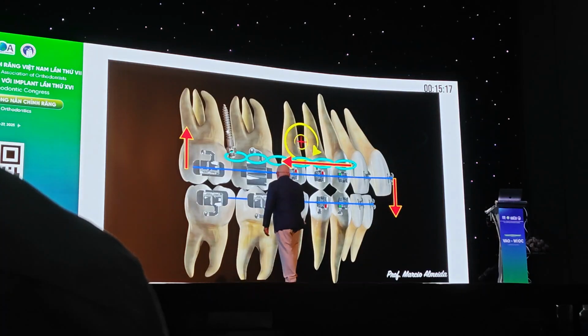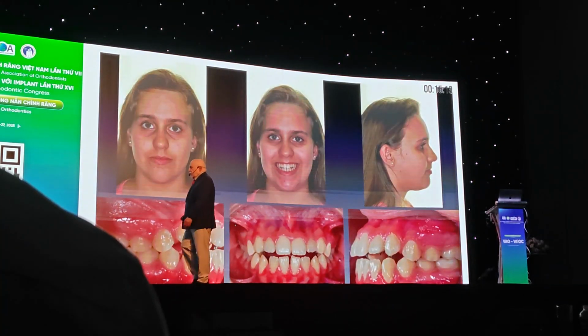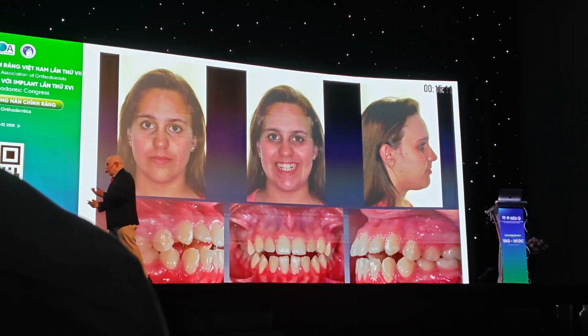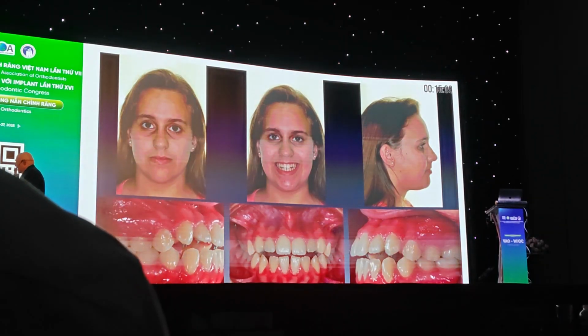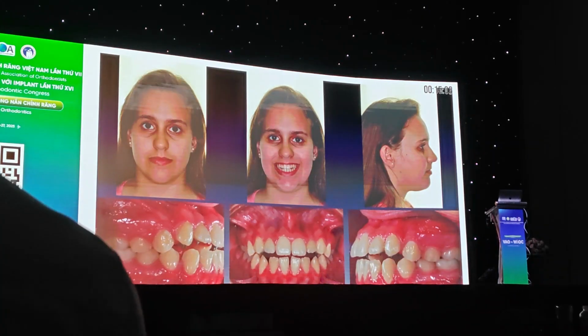Simultaneous correction of open bite. I want to show you a case from my friend Marcio. Take a look at this case. The buccal occlusion looks pretty good, and clearly there is a problem. He likes to use little spikes on the inside, which I personally don't like.